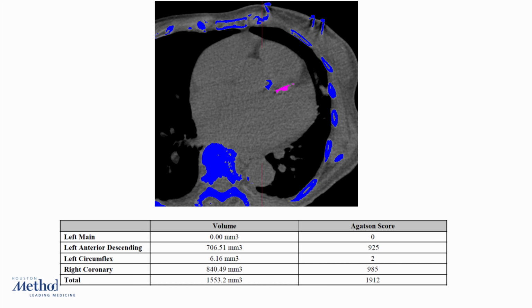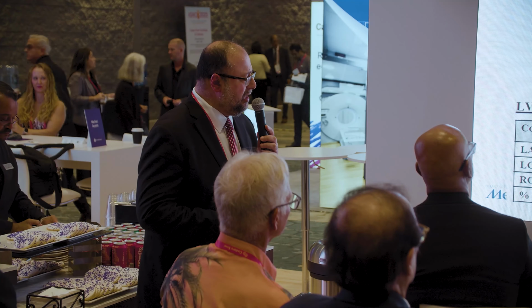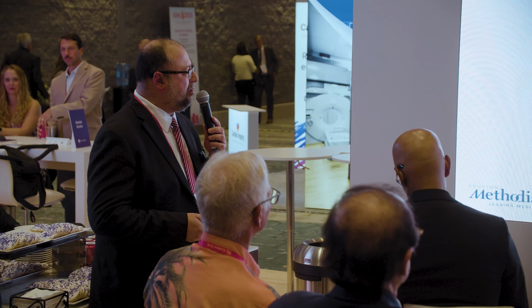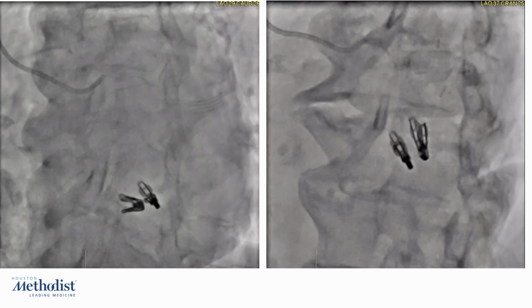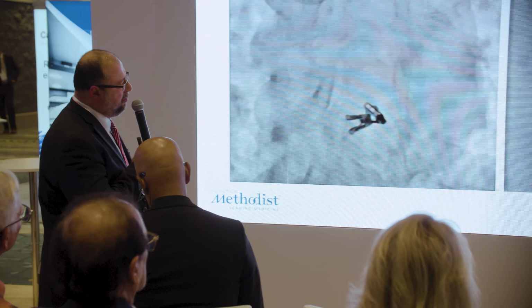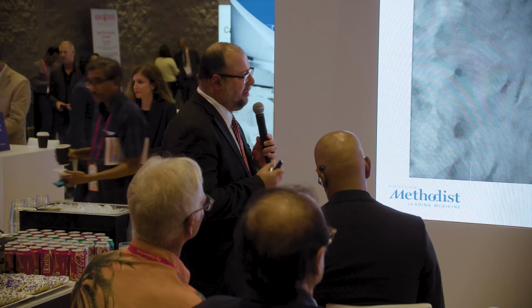So they were concerned whether we might be underestimating disease, although the flow is reassuring in terms of the RCA, although there is high calcium, and the flow limitation is probably more limited to the area of perfusion defect. And she did go to the cath lab, and she has a normal right system, but the LAD itself has a distal lesion which was labeled as 80% and which was stented. So you can see the stent there, and the prior one showed it there.